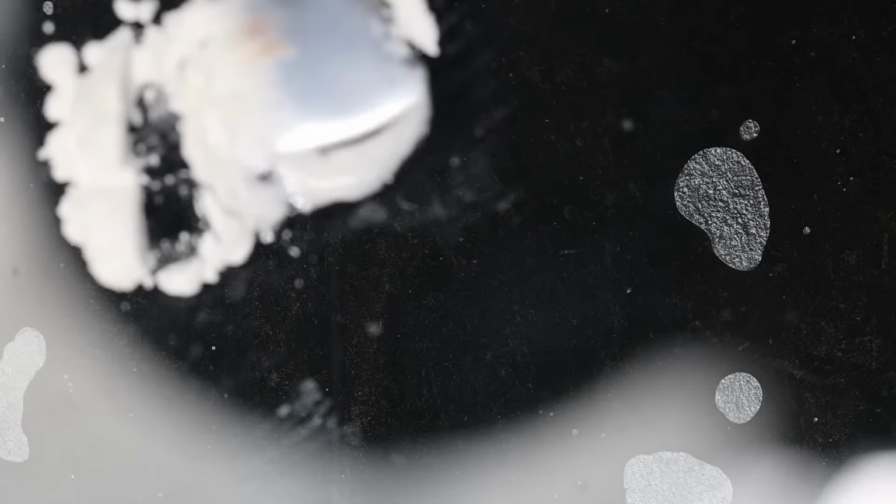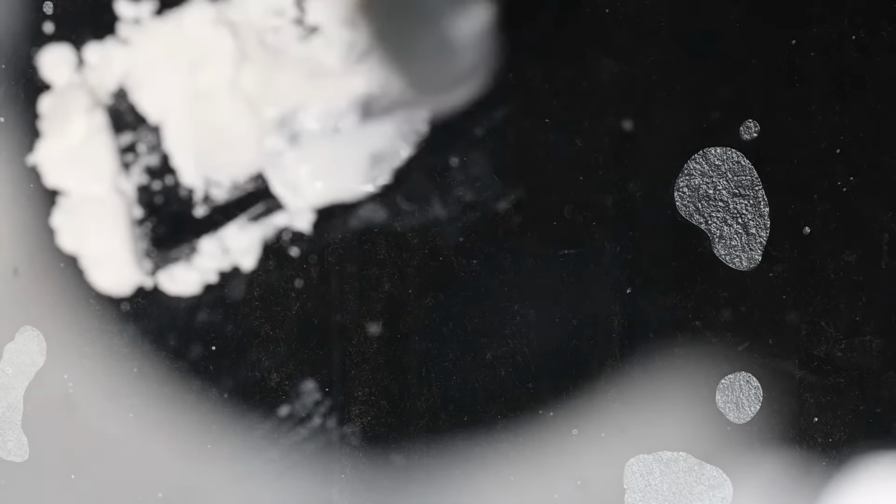Now we will use this clean spatula, and we will divide this into 3 increments, 1, 2. Okay, so we will just first mix this increment to have a putty like consistency.